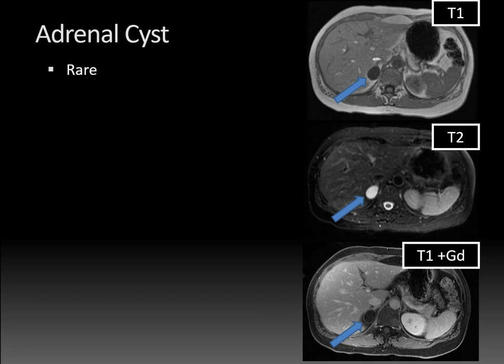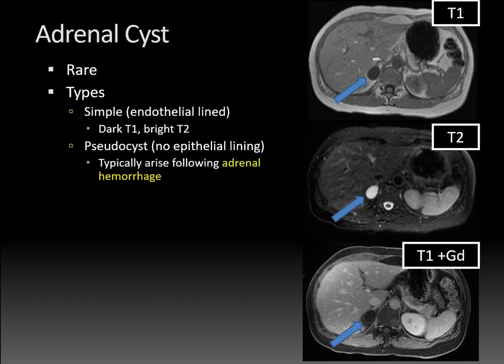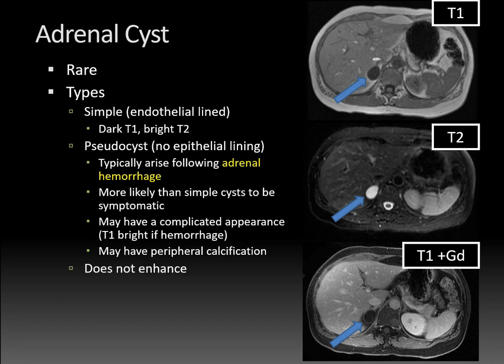Adrenal cysts are not very common. There are two major types: the simple type, which is endothelial-lined, tends to be dark on T1 and bright on T2 following simple fluid — like in this case. And then there's the pseudocyst, which has no epithelial lining. Pseudocysts usually arise following adrenal hemorrhage and are more likely than simple cysts to be symptomatic. They may have a complicated appearance with T1 bright signal if there's hemorrhage within them, which can also be T2 dark, and there may be peripheral calcification. If these become symptomatic, they can be removed laparoscopically.